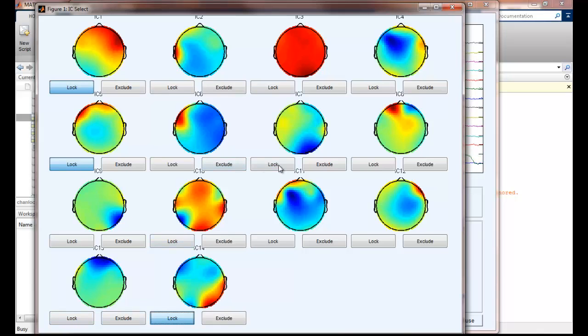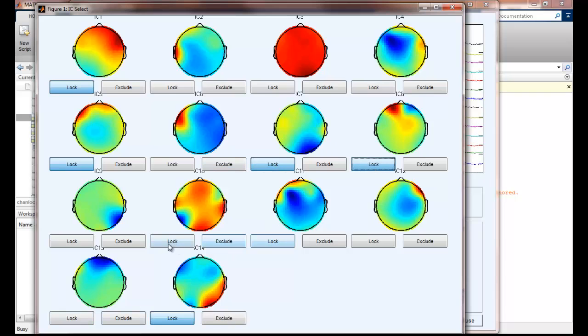We can also exclude the ones we don't like. We can see some informative components such as occipital and prefrontal ICs right now.